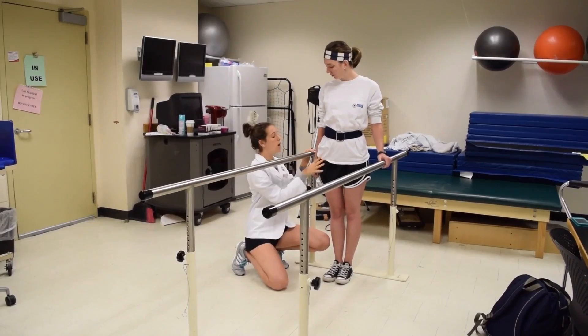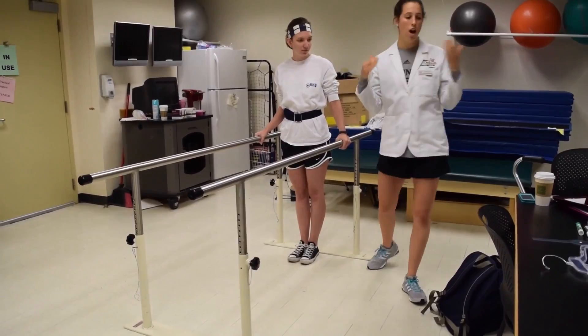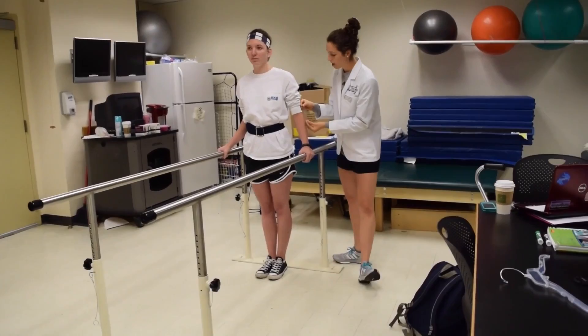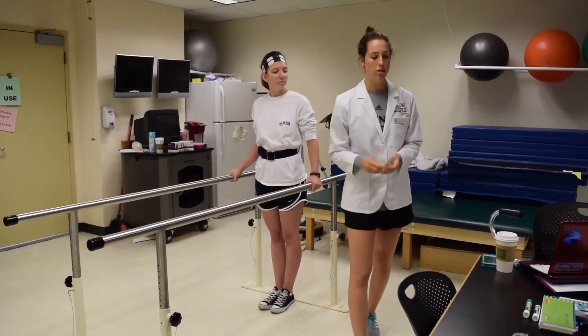I went ahead and placed the parallel bar about midway between those two points. If she were to rest her hands comfortably on the parallel bars, we're going to look for about 20 to 25 degrees of elbow flexion. When you're first getting started with this activity, you can use a goniometer if you want to be sure of the right degree of flexion, but as you get used to prepping this activity, you will be able to eyeball it.